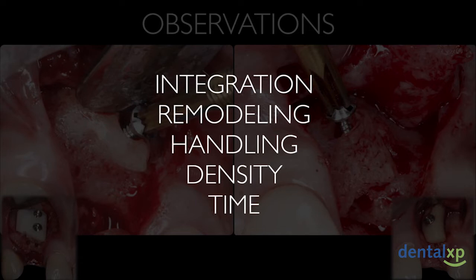And finally, in terms of time, both procedures are more extensive and time-consuming than GBR procedures. Both require more time to shape and adapt the blocks, and of course, the additional need of a donor site has to be taken into account for the autogenous graft.